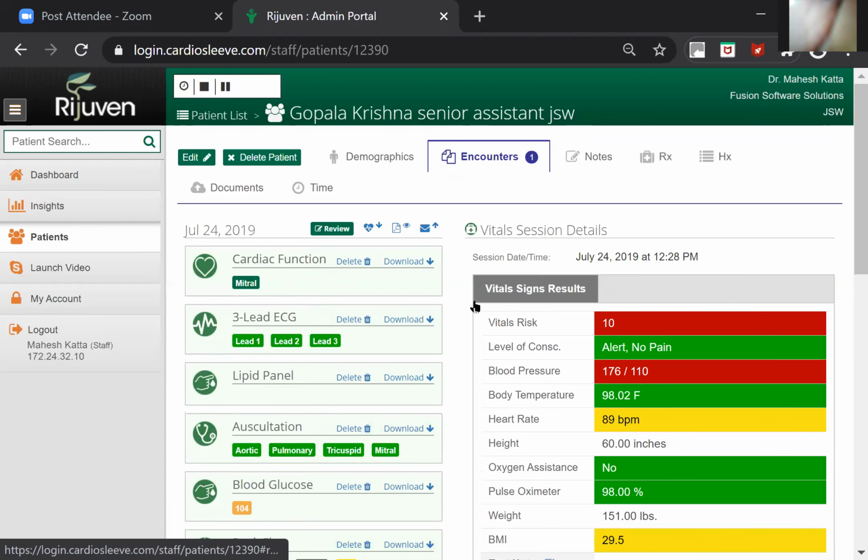Likewise, it saves time at the field level as well as at the periphery level. And everything is authentic. Everything is reported. You have the EMR, electronic medical records, of a patient as proof. Of course, those legal things are very prominent in the US and Australia and all those countries, right? So they have a record. The doctor has all the records here, with the analysis.